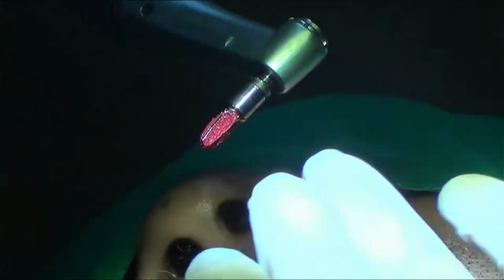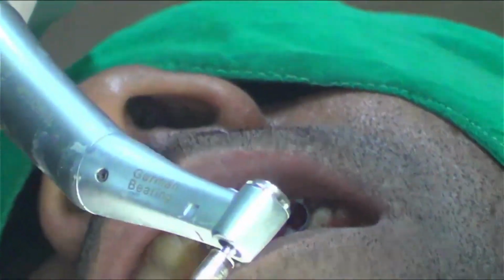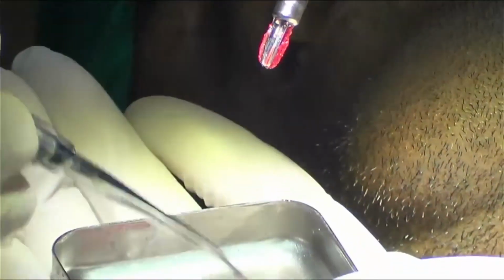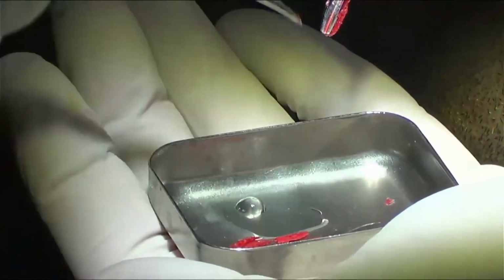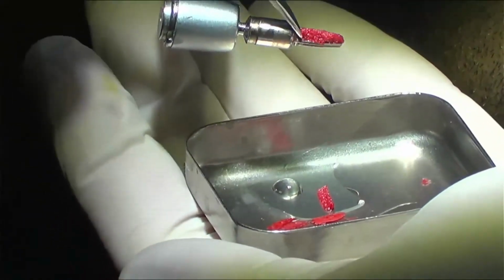You again see, this is from the second osteotomy. Okay, so we can take this. This is like gold to an implant surgeon.